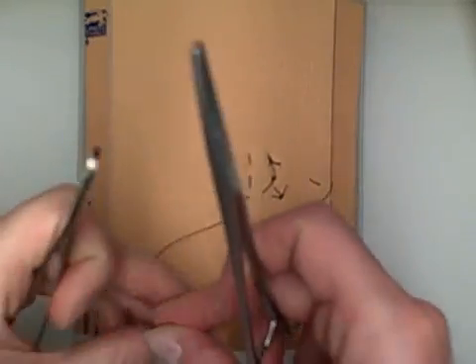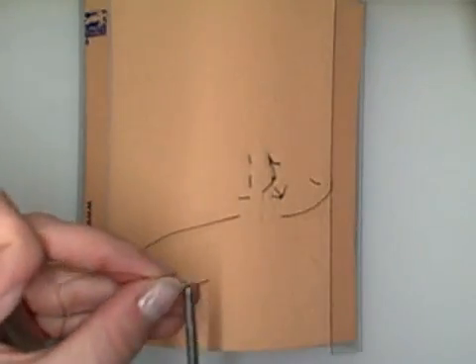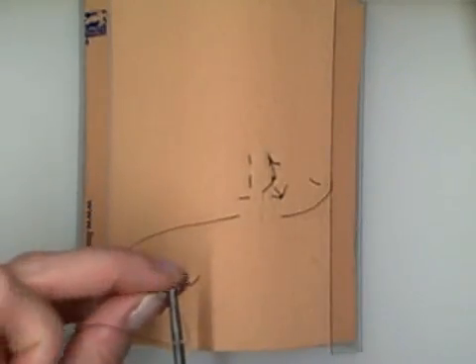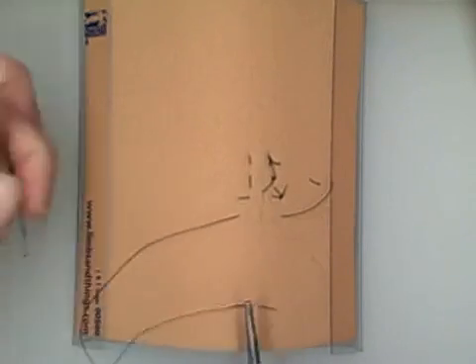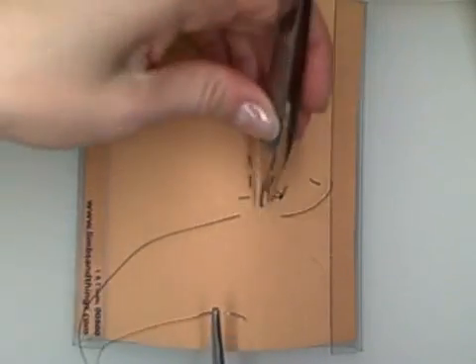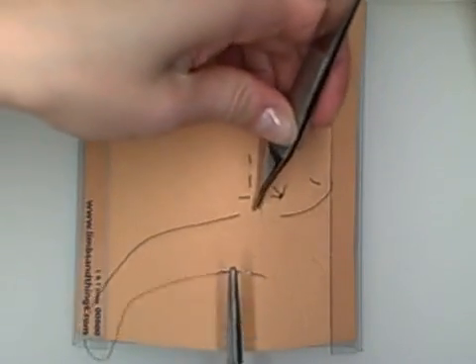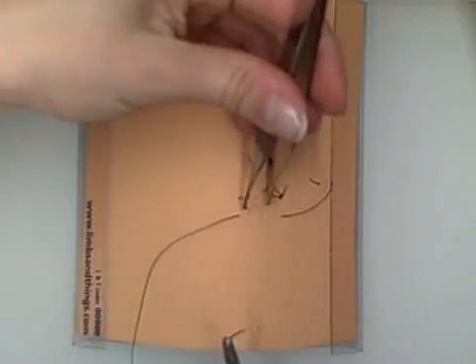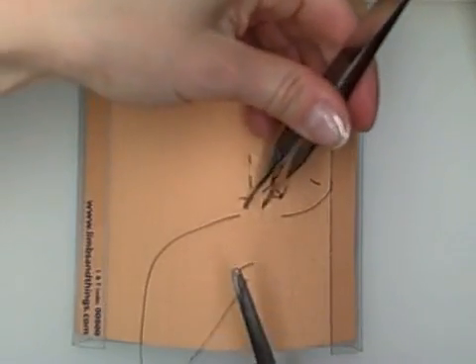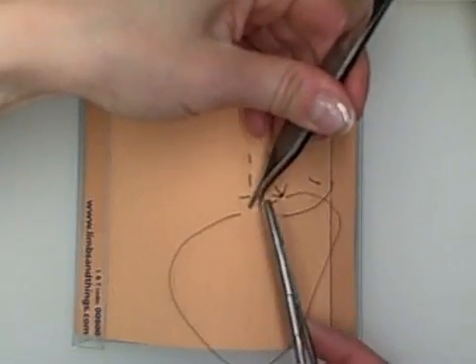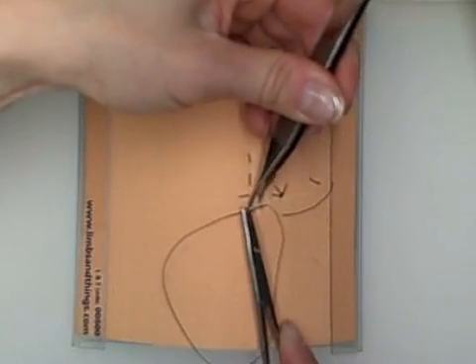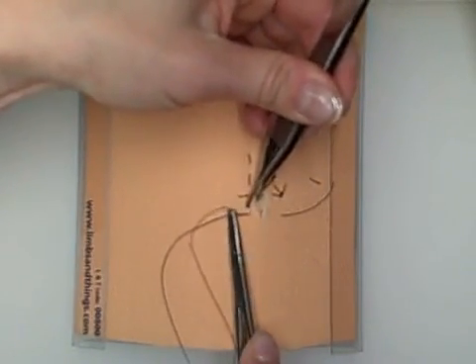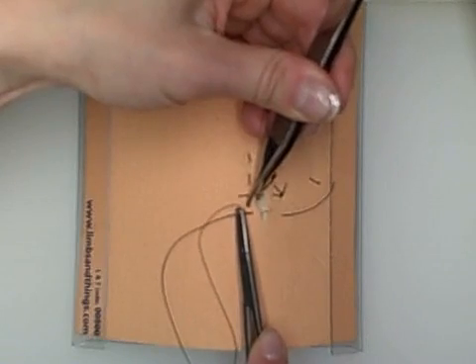And then remember, you're going to reload your needle backwards. And the near, near bites are going to be very shallow. So far, far is deep, deep. Near, near is shallow, shallow.